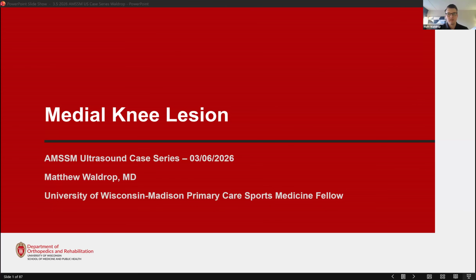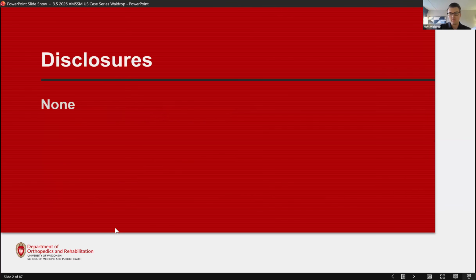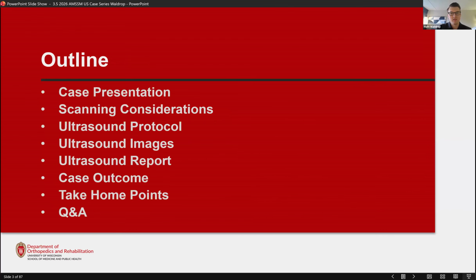All right. Hi, everybody. I'm Matt Waldrop. I'm the primary care sports medicine fellow at UW-Madison this year, and we will go ahead and get started with this ultrasound case of a medial knee lesion. I've got no disclosures. So we will start with the case presentation, some scanning considerations, and ultrasound protocol for the medial knee. We'll then move on to the images themselves and the ultrasound report, and then we'll wrap things up with the outcome of the case, some take-home points, and any questions that you might have.